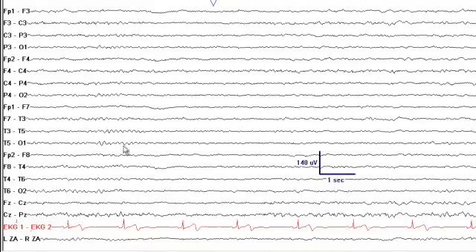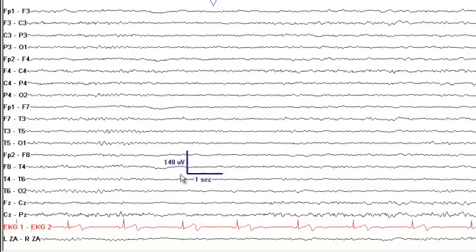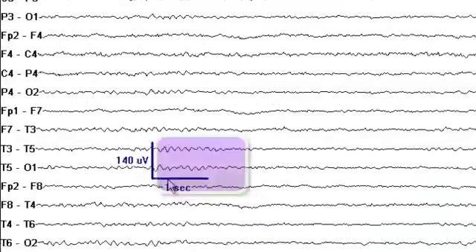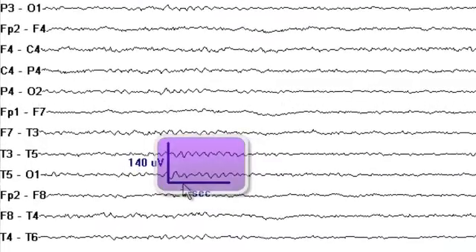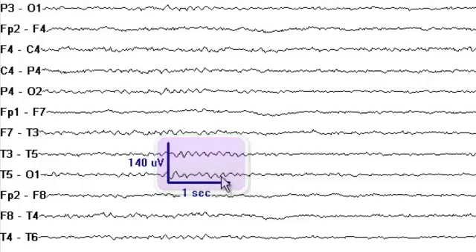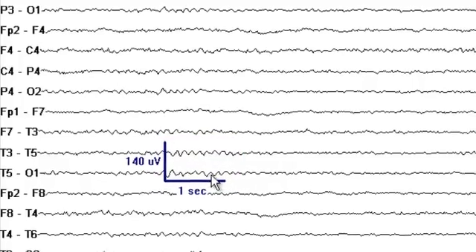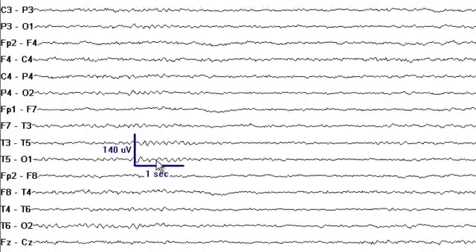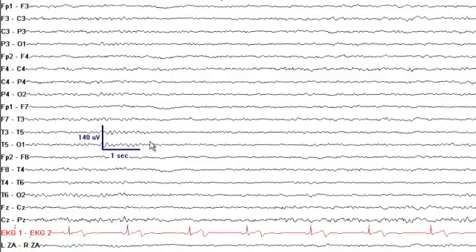You notice some theta frequency here. Counting the number of waves within one second, you get approximately 7 to 7.5 cycles, confirming this is theta frequency activity.